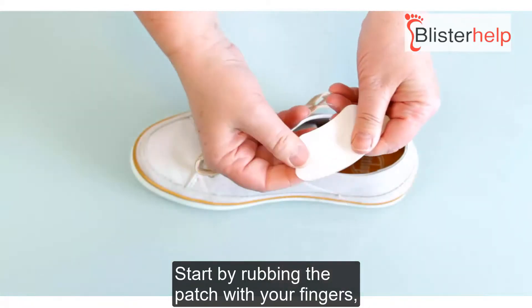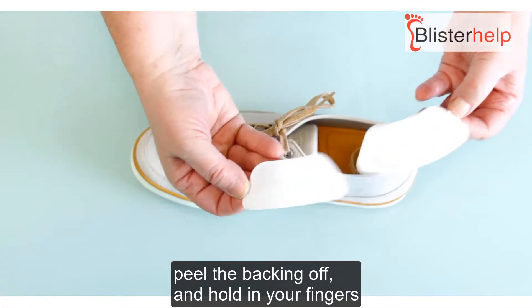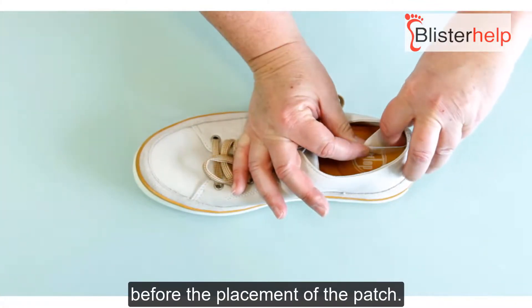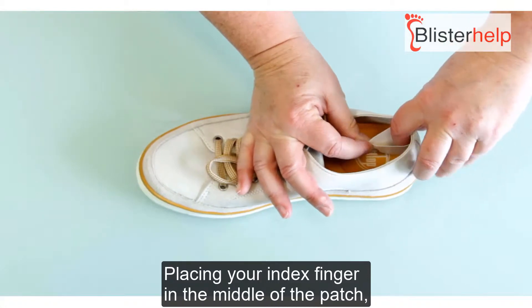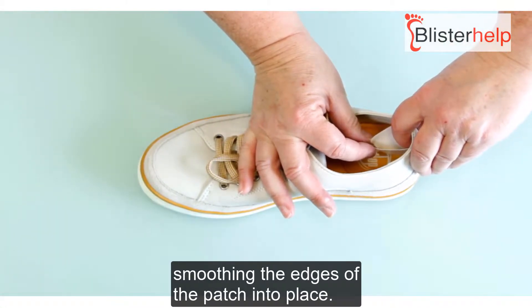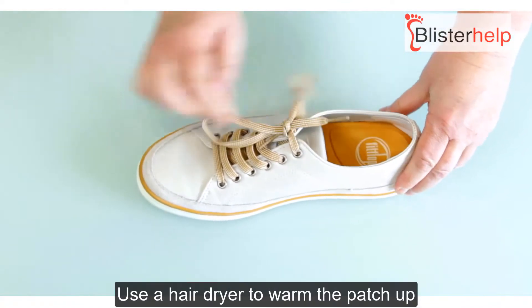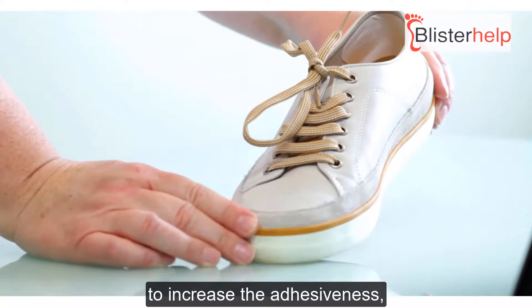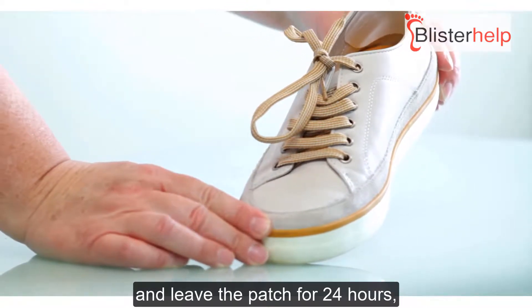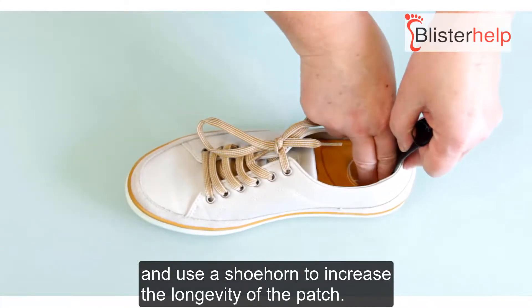Start by rubbing the patch with your fingers, peel the backing off, and hold your fingers before placement. Place your index finger in the middle of the patch, securing the centre to the back of the shoe and smoothing the edges into place. Use a hairdryer to warm the patch up to increase the adhesiveness, leave the patch for 24 hours, and use a shoehorn to increase the longevity of the patch.